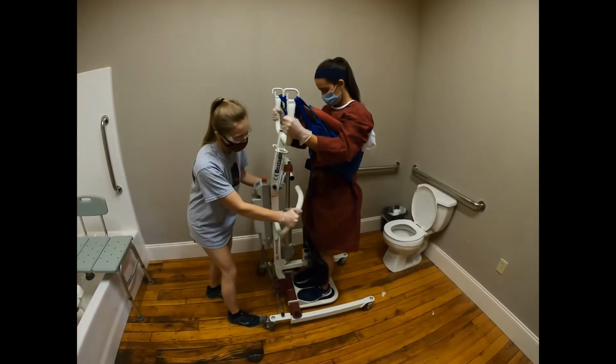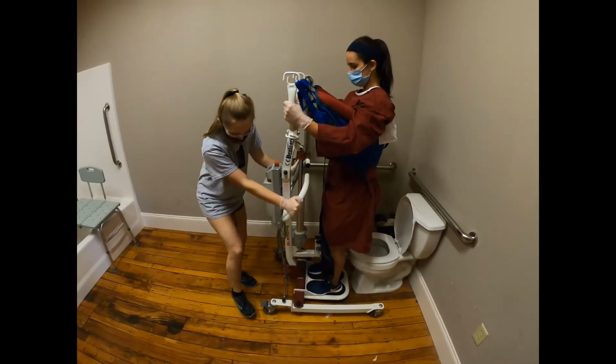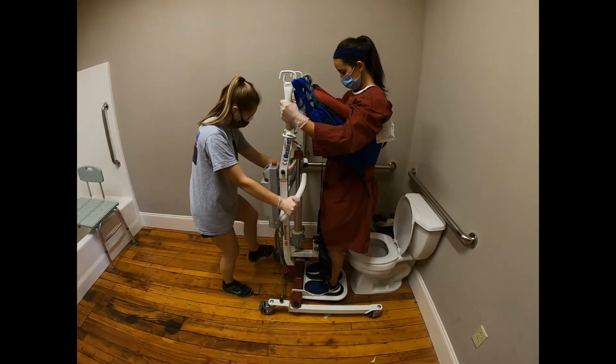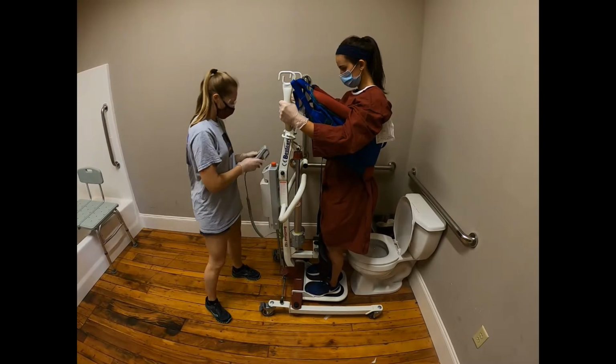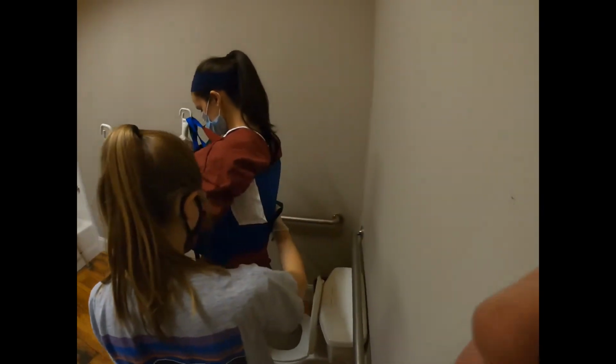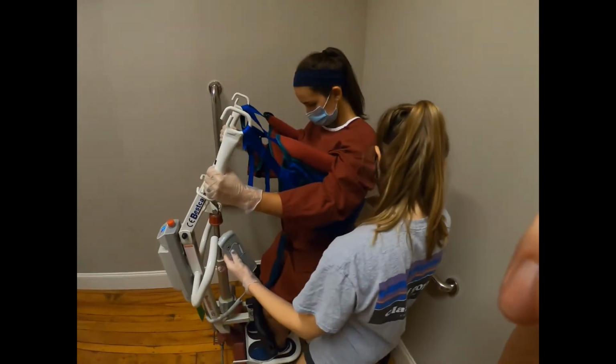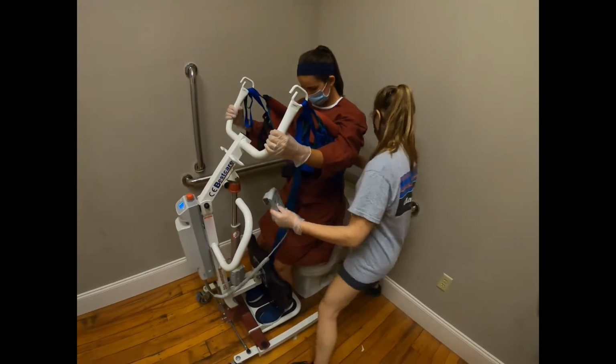This is a toilet transfer with a sit-to-stand machine. With your loved one secure in the sit-to-stand machine, position them so that they are ready to assume a sitting position on the toilet. Stop when you see or feel the back of their knees come in contact with the toilet and then lock the brakes. Use the control button to lower your loved one onto the toilet as you use your arm for additional back support while moving into the seated position.